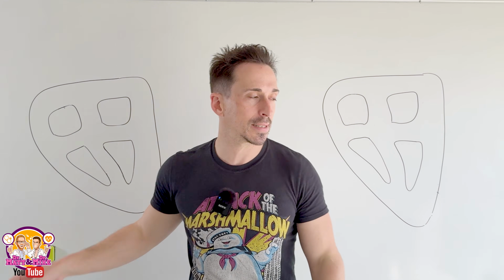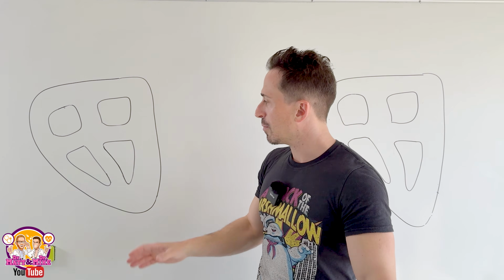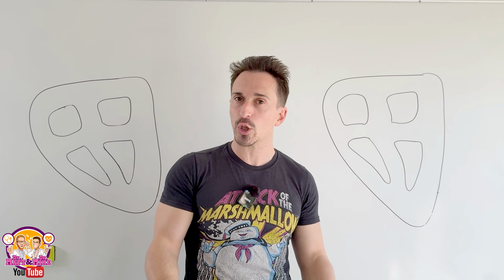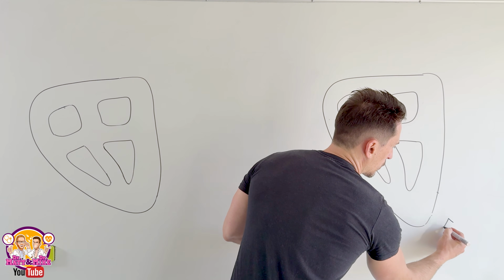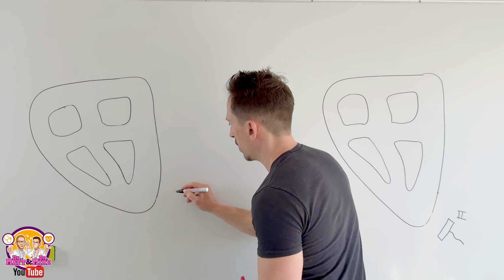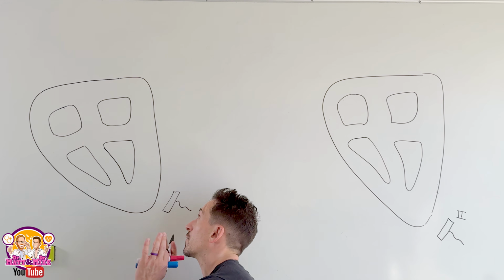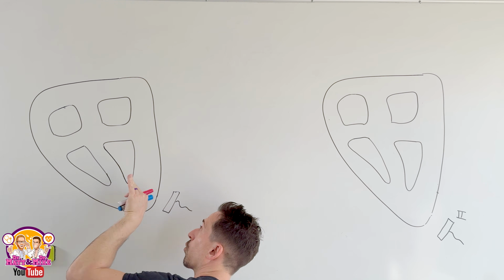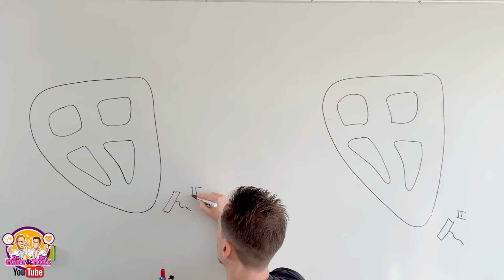Now, I've drawn up two hearts here because I need to show you what's happening in ST elevation and ST depression. But first, I want to talk to you about what happens in a normal heart that a heart attack is not happening in. So, we've got a lead that actually looks at the heart from this direction. I'm going to draw it on both of the hearts. So this lead is looking at the heart like this, from this angle up. And what it's doing is it's picking up what's happening either towards it or away from it electrically. That's important. This is what we call lead 2.